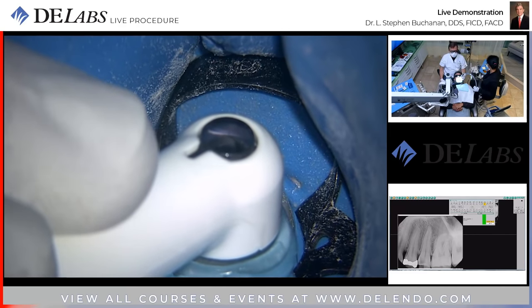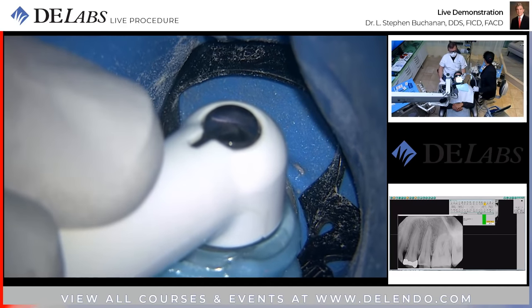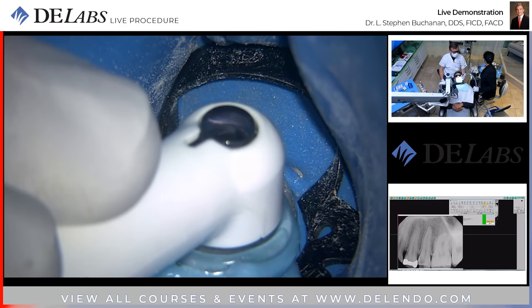So we're at 3 minutes. I always run the longest cycle because why wouldn't I? You never know how many lateral canals need to get cleaned out.